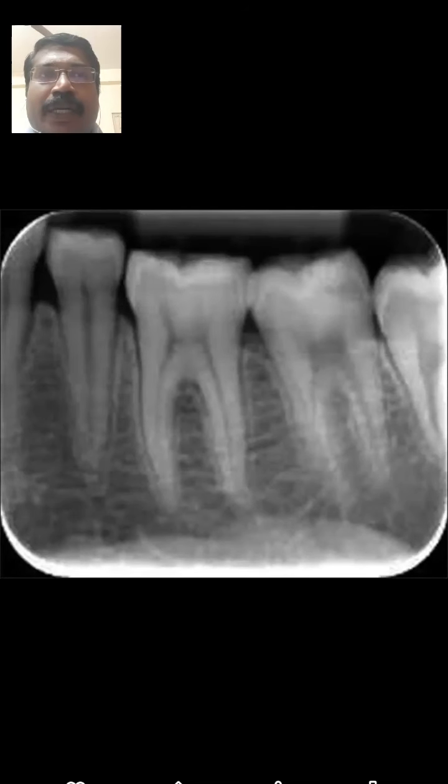What is meant by an adequate diagnostic image? An essential first step is making sure that there are an adequate number of images of diagnostic quality that display the region of interest in detail. The radiographs that we take should give the proper information on the normal variation as well as the abnormal pathological variations in that area of interest.